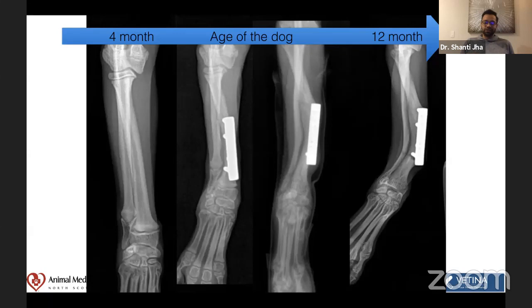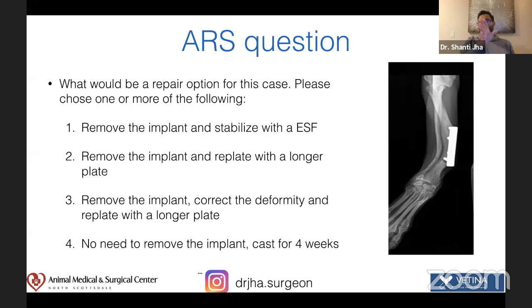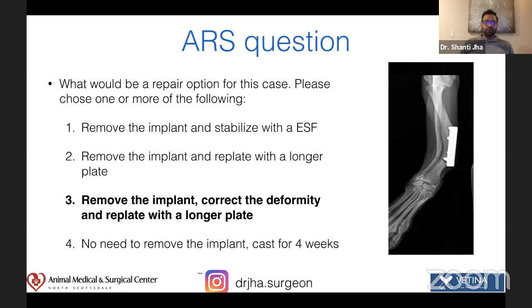Anyhow, so now you have a reverse C. The dog's leg is completely valgus. The other leg is straight and this is in a completely different direction. What would you do? Would you remove the implant and stabilize with an external fixator? Would you remove the implant and replate with a longer plate? Or would you remove the implant, correct the angular deformity, and then replate with a longer plate? Or just go back to casting? Well, the best answer here is do the right thing. The right thing would be to remove the implant, correct the deformity, and replate with a longer plate.